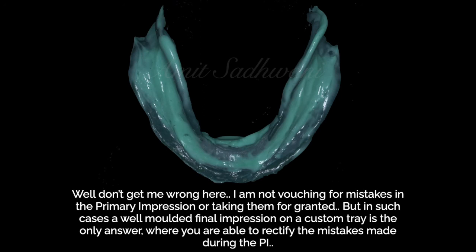like for example the final impression, which is made with a custom tray and border molded with green stick, and a wash impression made either with a light body or with zinc oxide eugenol paste. Well, don't get me wrong here. I'm really not vouching for the mistakes we make during the primary impression, or taking those mistakes for granted. But in such cases, a well molded final impression is the only answer, where you are able to rectify the mistakes made during the primary impression. You're getting a second chance here, isn't it?